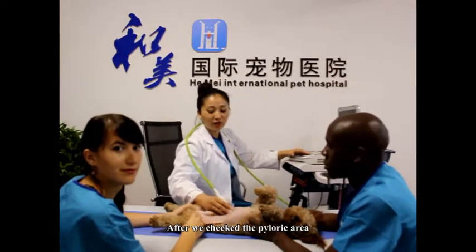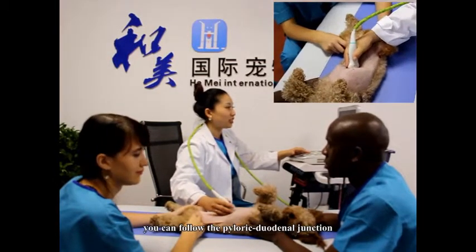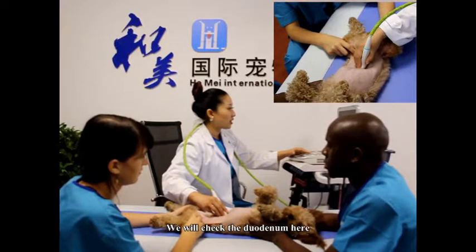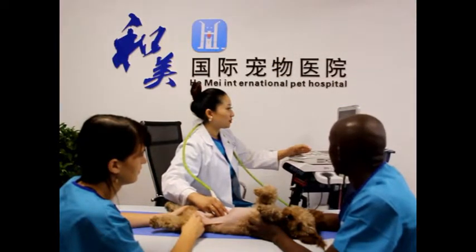After we check the pylorus area, you can follow the pylorus duodenal junction and find the duodenal area, and we will check the duodenum here. This is the image of the duodenum.